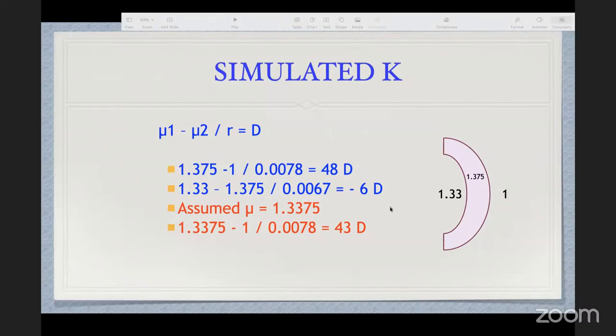Posterior keratoconus. Yes. So keratoconus is a disease which starts with the posterior surface. All your topographs will miss early keratoconus because it is starting at the posterior surface and it is just assuming that the posterior surface is normal. So that is why Scheimpflug imaging is always better than a conventional topograph.